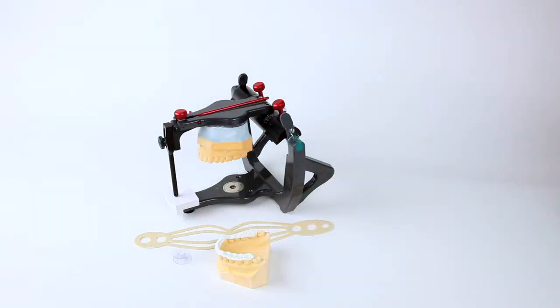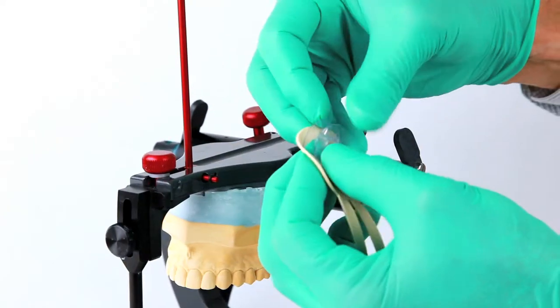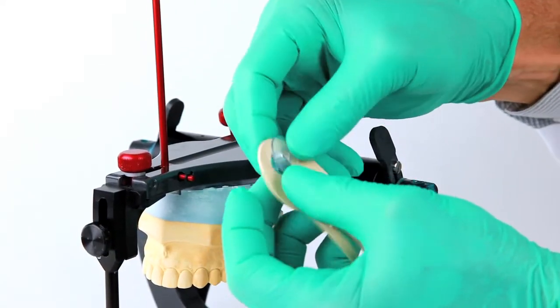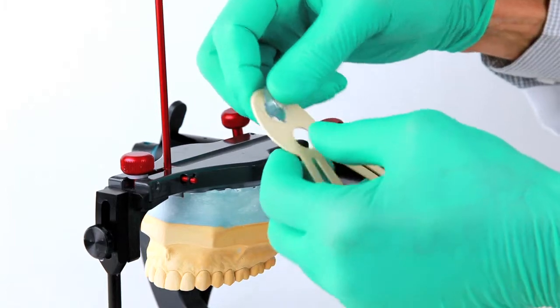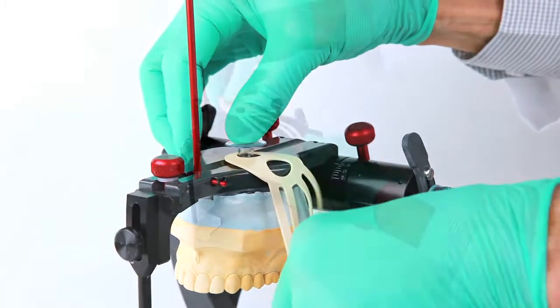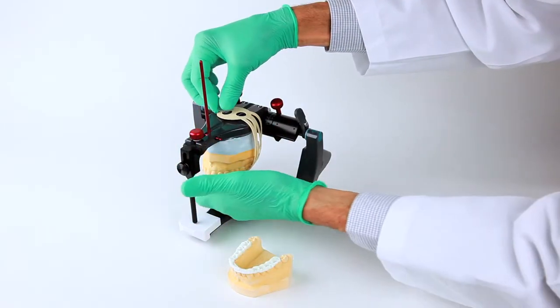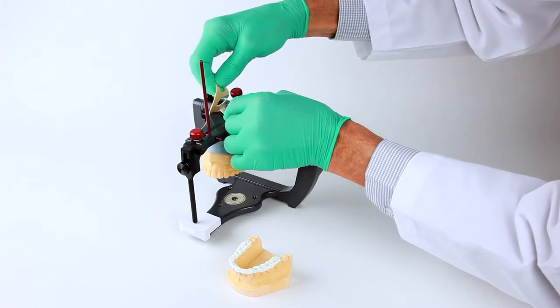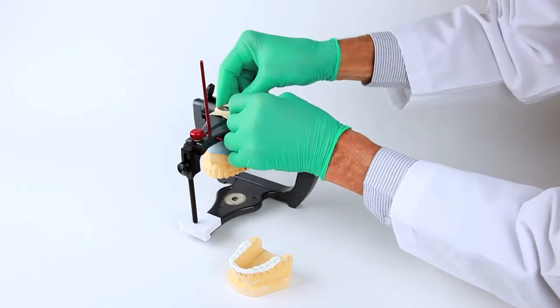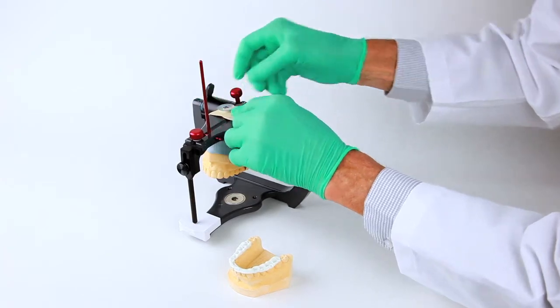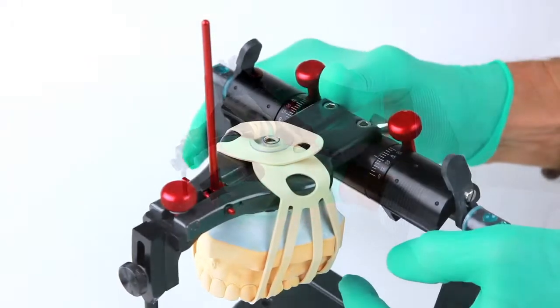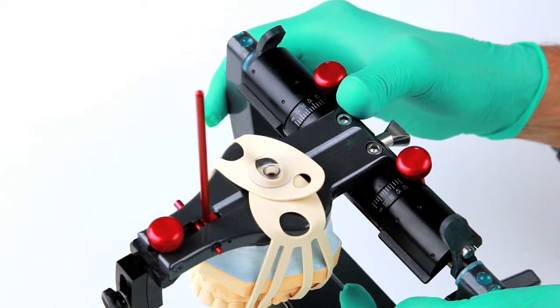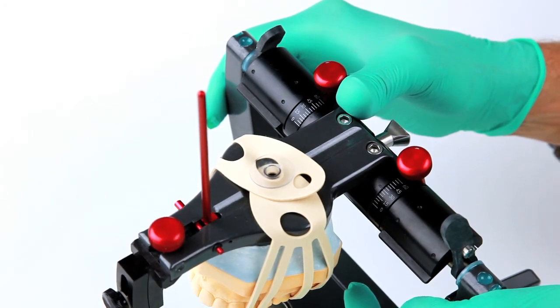Once the maxillary cast has been mounted with a mounting jig or facebow registration, the flexi-mount is attached by placing one end of the two large holes on the end of the flexi-mount over the mounting button. The other hand draws the free end of the flexi-mount under the cast to the other side of the articulator arm, and it attaches to the same mounting button as the opposite end of the flexi-mount was previously attached.